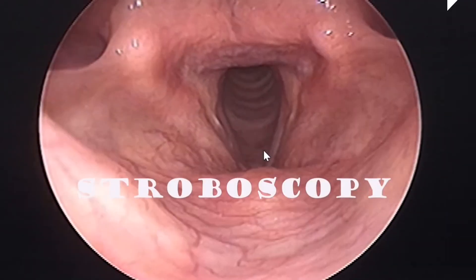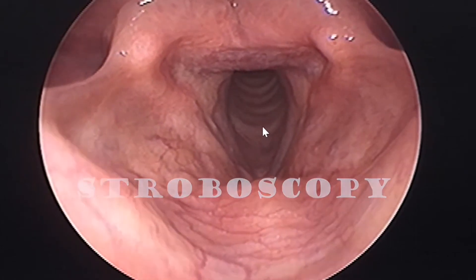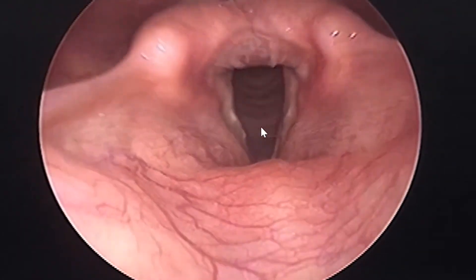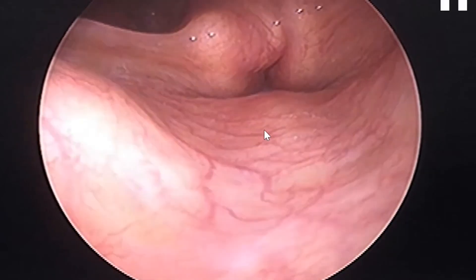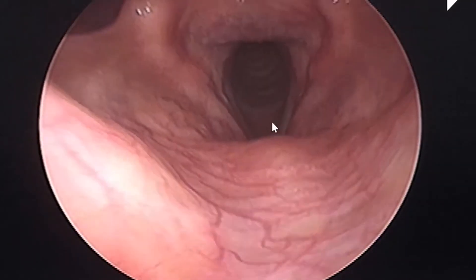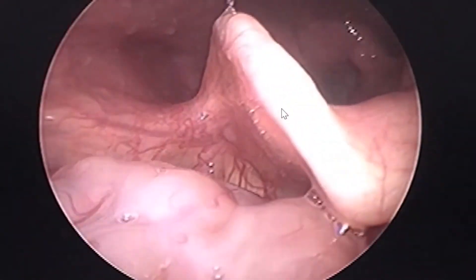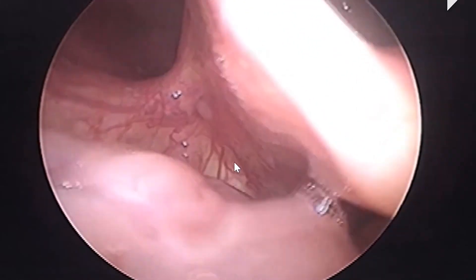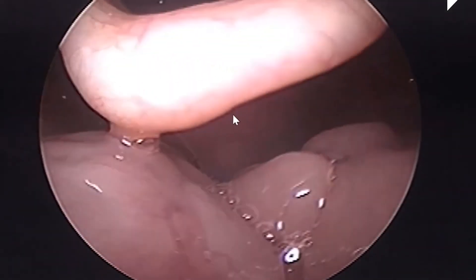This closing cycle can be studied better with a stroboscope, another fine instrument — you can learn about stroboscopy in another video. Notice the fine movement of the vocal cords on saying 'e', which is called adducting the vocal cords.